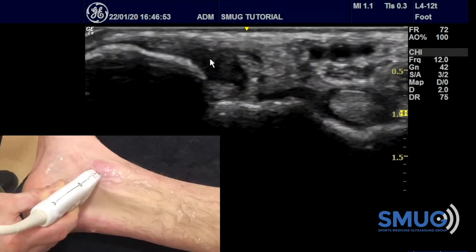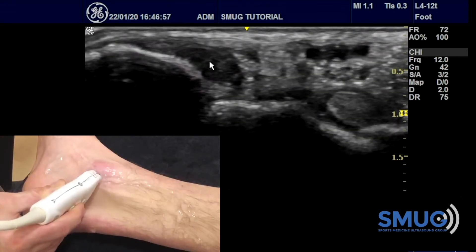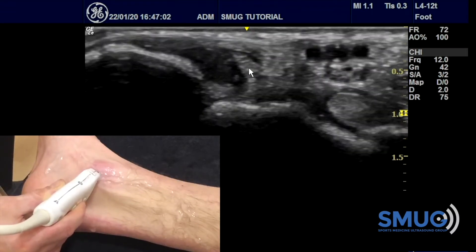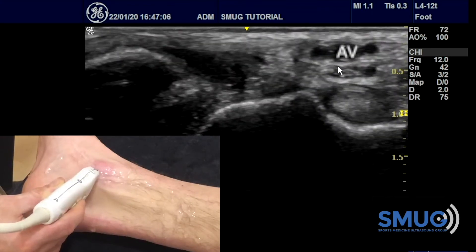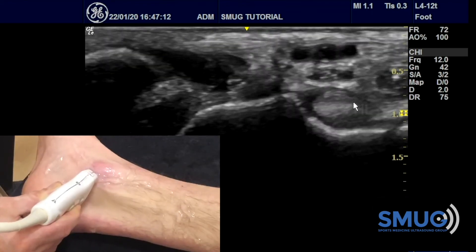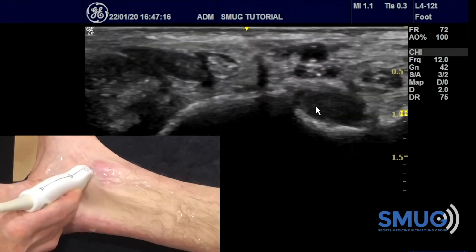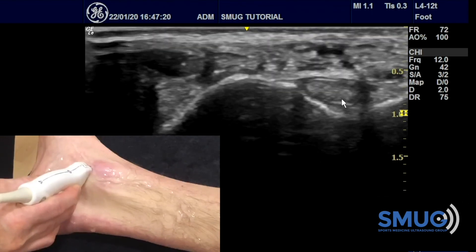Underneath that is the flexor hallucis longus, so within one picture you get all these structures, and once you have them you can trace them distally and proximally. We refer to that as Tom, Dick, and Harry: tibialis posterior, flexor digitorum longus, then the arteries and veins, the nerve, and then the flexor hallucis longus. Once you have your landmark you can spin on it, go distal and proximal, and be confident that you're on the right spot.